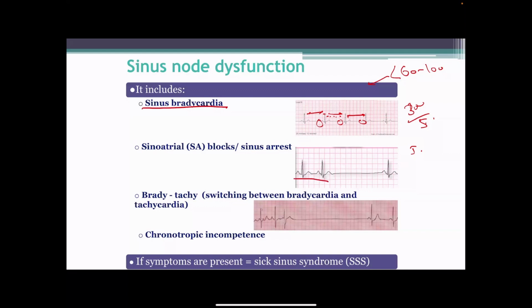What if everything is normal, but then it stops suddenly, then it continues? It means sinus arrest. Like anything electrical, or a device, or batteries, or electricity in general, it can have a malfunction where it hangs for a bit. The same thing can happen in the sinoatrial node. It just kind of pauses for a bit sometimes.